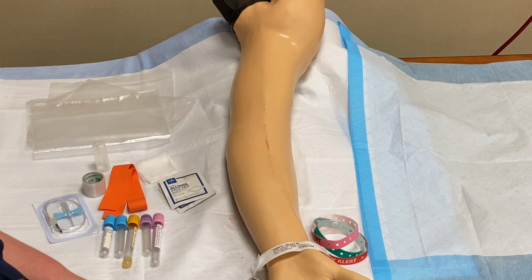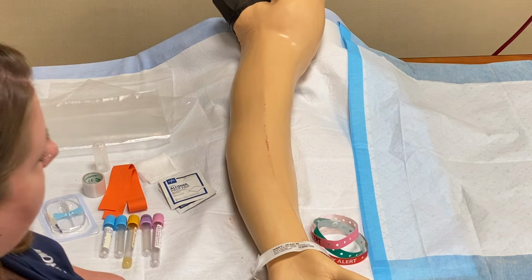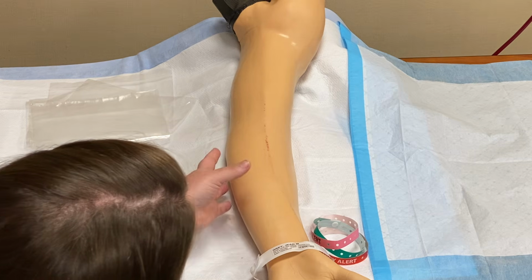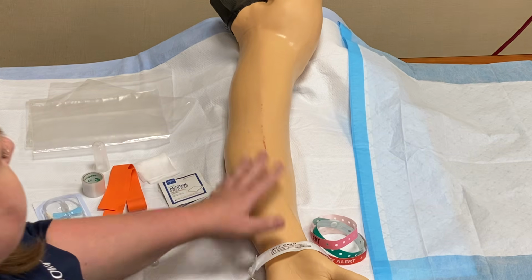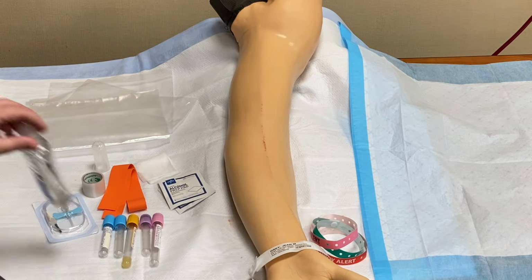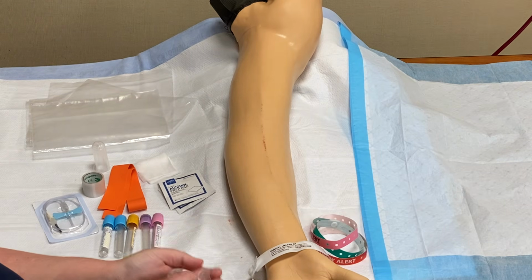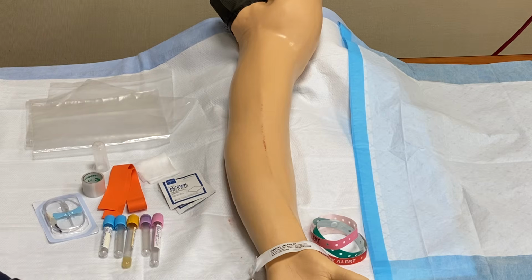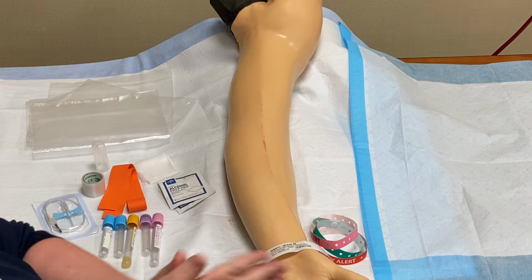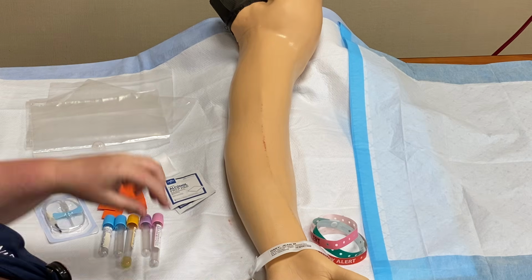At this point, I actually want to look at her arm and make sure that her arm is good for use. She has a restriction on the right arm, so I'm looking at the left arm, and I'm going to look for bruising, wounds, rashes, burns, anything that's going to stop me from using this arm. I don't see anything on this arm, so I know I'm good to find a vein. So I'm going to grab my tourniquet, and my tourniquet has a time limit of one minute, so I can't leave it on longer than a minute.